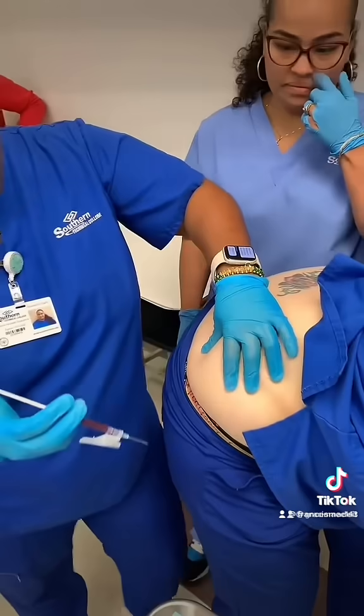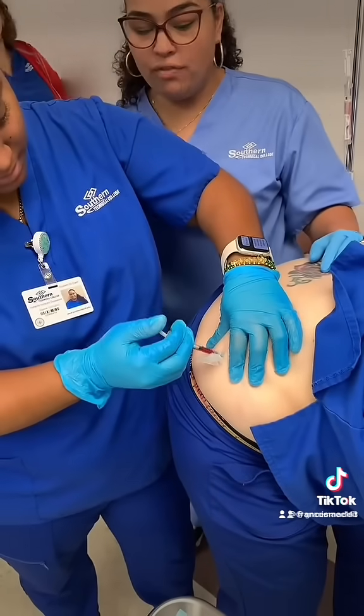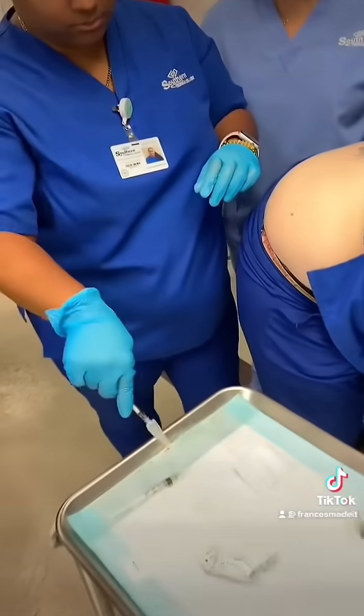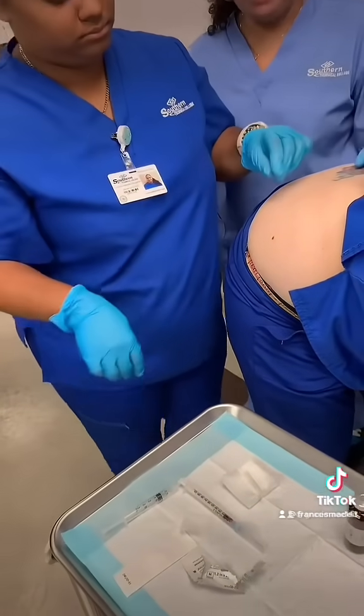Always let the patient know they're going to feel a pinch. You break the skin, then withdraw quickly. Safety. Excellent — and then you just put a band-aid on.